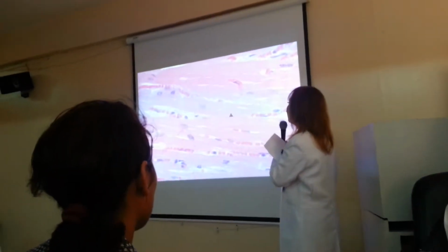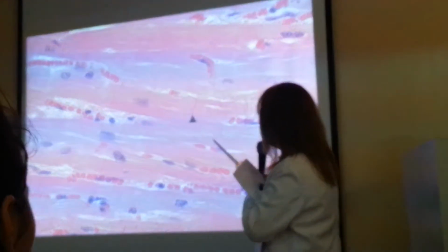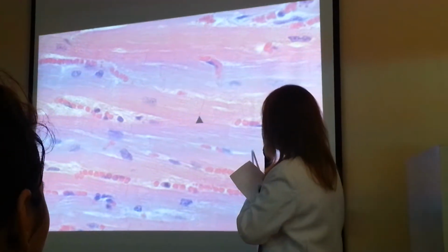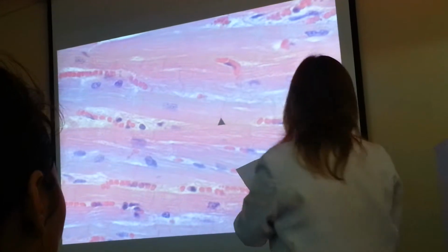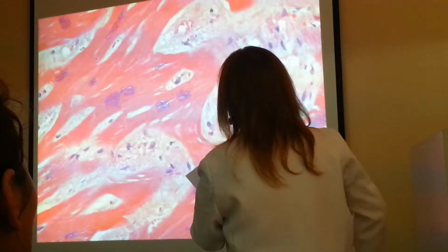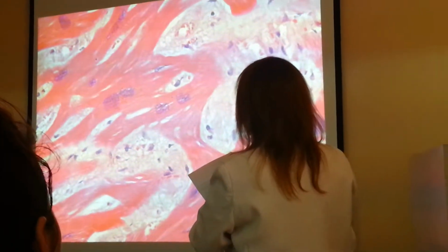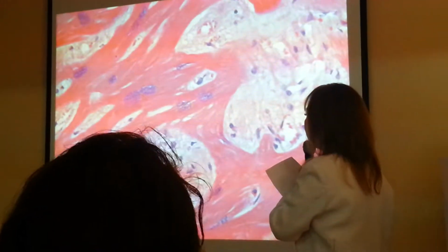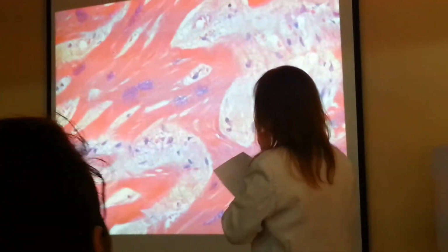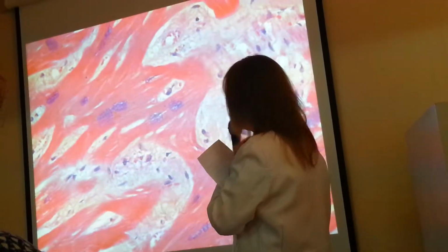Not important for our topic. The striations, you can probably see a little bit of zigzag striations, and that is normal for the heart. And so with hypertrophy, is this hypertrophy already? So you can already see, I think this patient has MI, and these are inflammatory cells. Just ignore that because we are not still under inflammation yet. We are still going through hypertrophy.